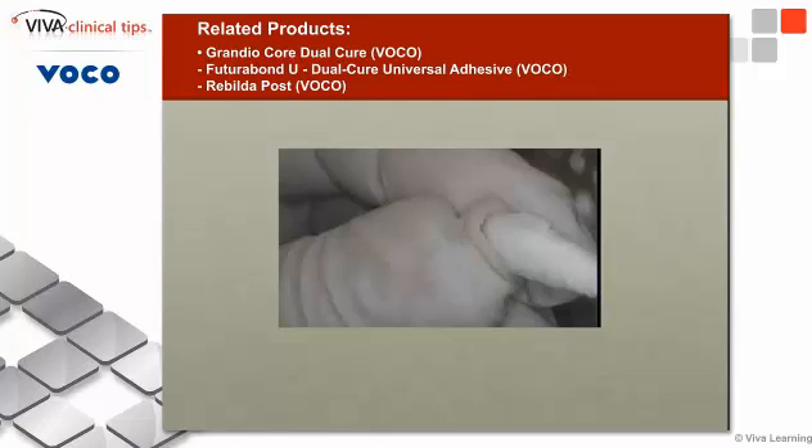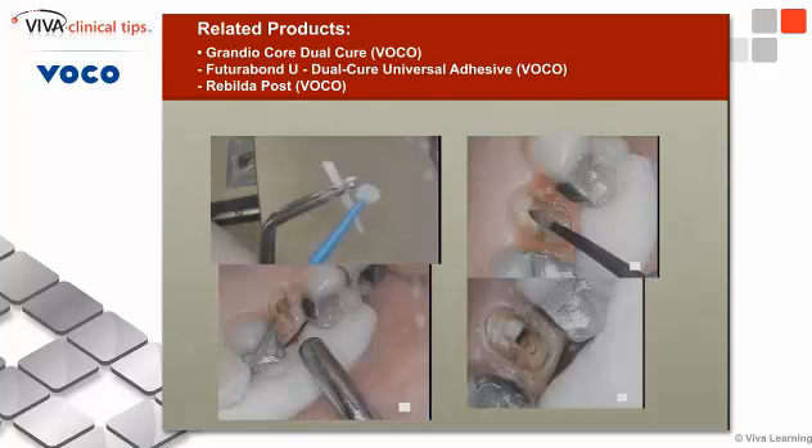I placed a little bit of Vaseline inside the crown because what I'm going to do is actually do a reverse core build-up here — I don't want the material sticking to the crown, that's the last thing I want. I then place the bonding agent on the upper left there, and place the bonding agent onto the post.